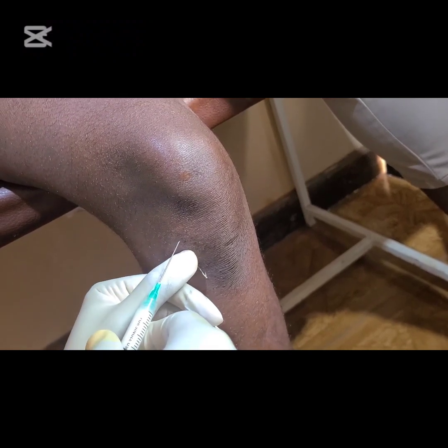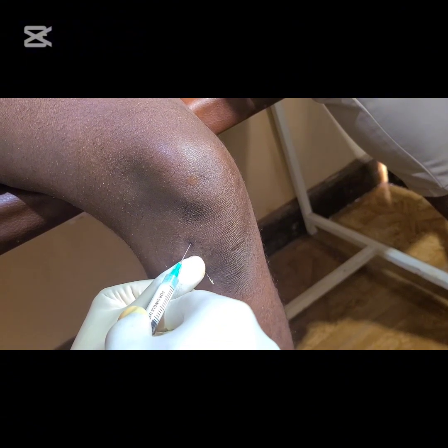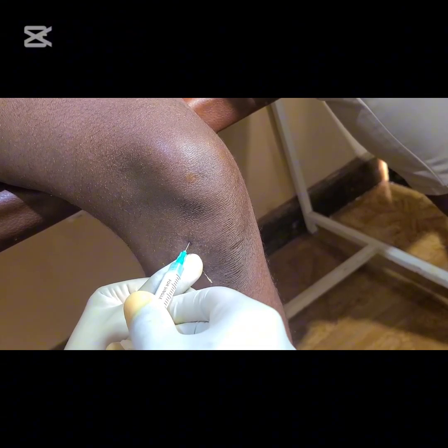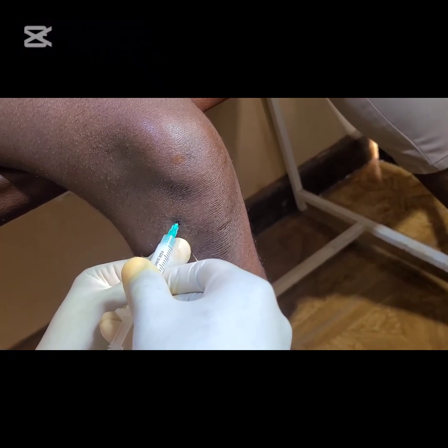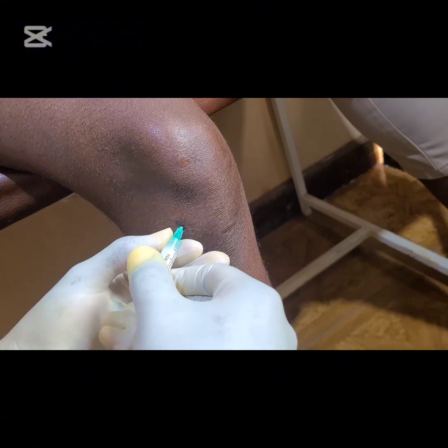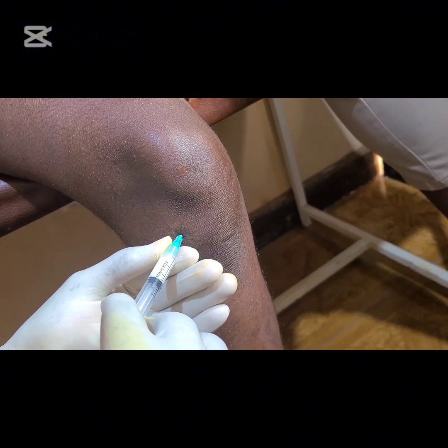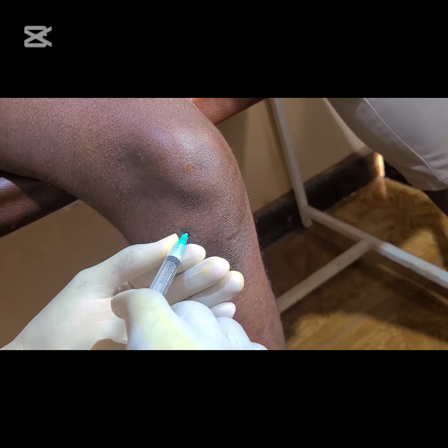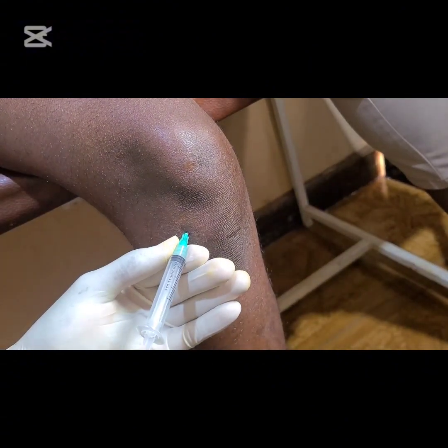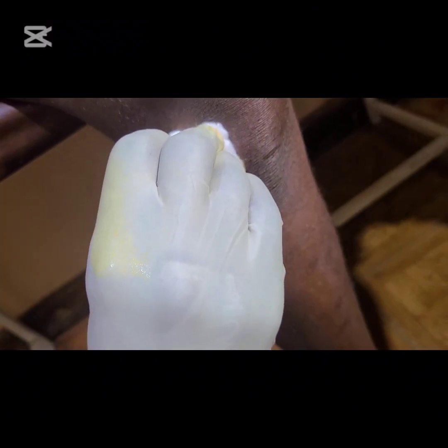Then we shall get the syringe that contains the steroid drug. Of course, open the cap and introduce the needle into the knee. Our aim is to get into the knee cavity. So we shall maintain the needle in a horizontal plane, but as we are entering, our direction will be posteromedial. After reaching the cavity, of course, we shall aspirate and see whether we are in a vessel or not. After seeing that we are not in the vessel, we shall advance the drug and remove the syringe, or remove the needle.